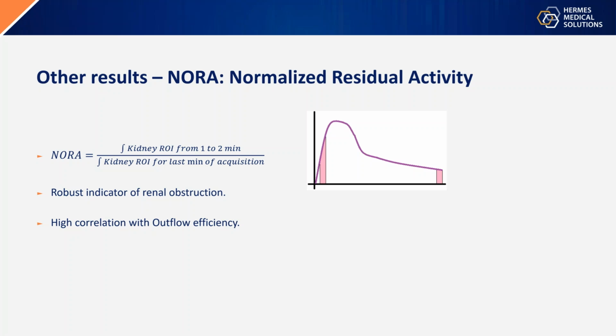I think that's the question. I'm sorry, is the question whether it affects your results or the Patlak? I guess you mean the Patlak. I think she's trying to say if they changed collimator to this ultra high res versus a standard high res, would they be expecting a quantitative change in the transit times?